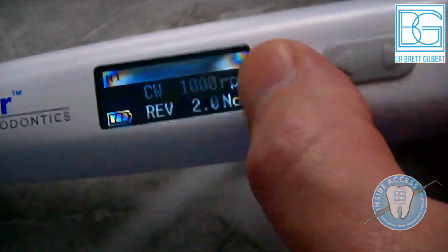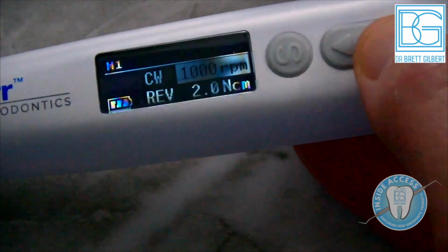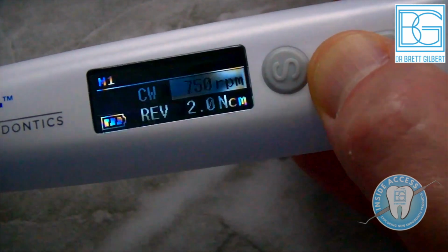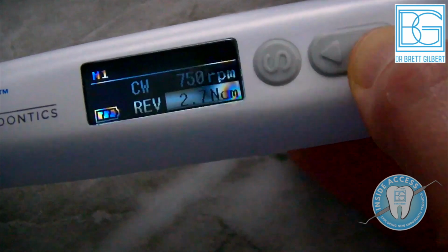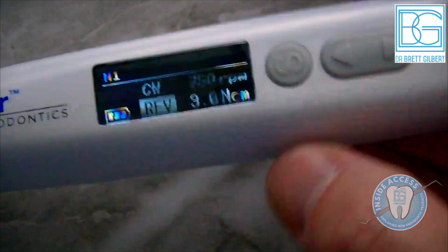So we can set these here. We can set the clockwise or counterclockwise. As you can see, you can set the RPMs either up or down. And you can see 950, 900, 850, 800. Again, you can set the torque all the way up to 4 Newton centimeters on these. So lots of different options for any type of file that you use.